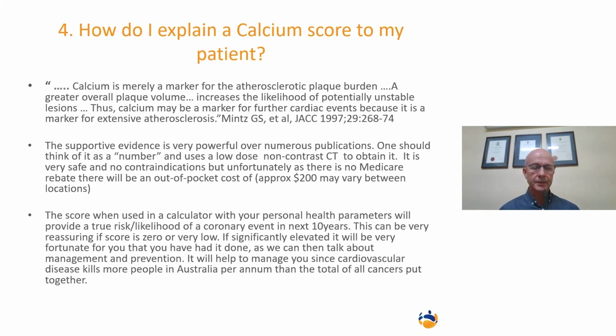In fact, many studies show that young patients, the age 36 to 42, 90% will have a 0 calcium score, making it an almost normal result, but does not clear the person of having plaque. It merely shows that they have not had plaque for long enough for it to calcify. One could see this as an iceberg, where at the bottom of the iceberg is slow atherosclerosis, but we only see the calcification when we see the tip of the iceberg.